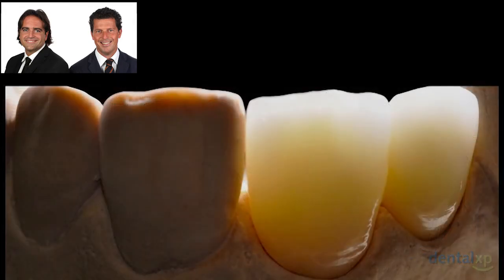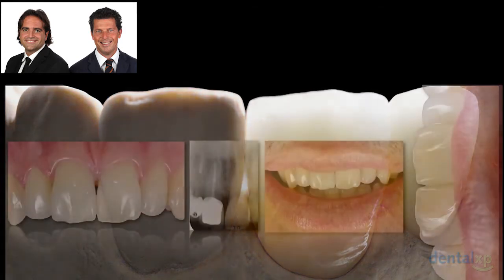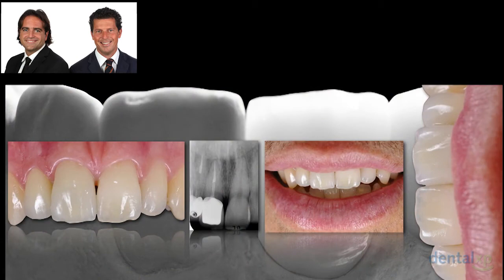And see that also zirconia can be translucent. Of course, you need to work with high-quality zirconia. Of course, you need to work with the right dental technician that knows how to use the characteristics of the material to our own advantage. And if everything has been done properly, this is the final result that you can achieve. And like this, we are sure that we improve the quality of life of the patient.